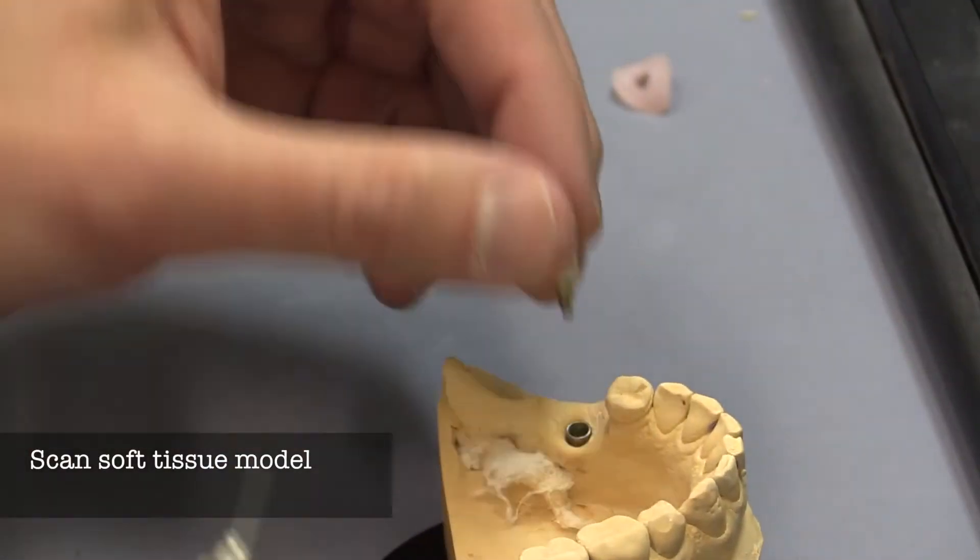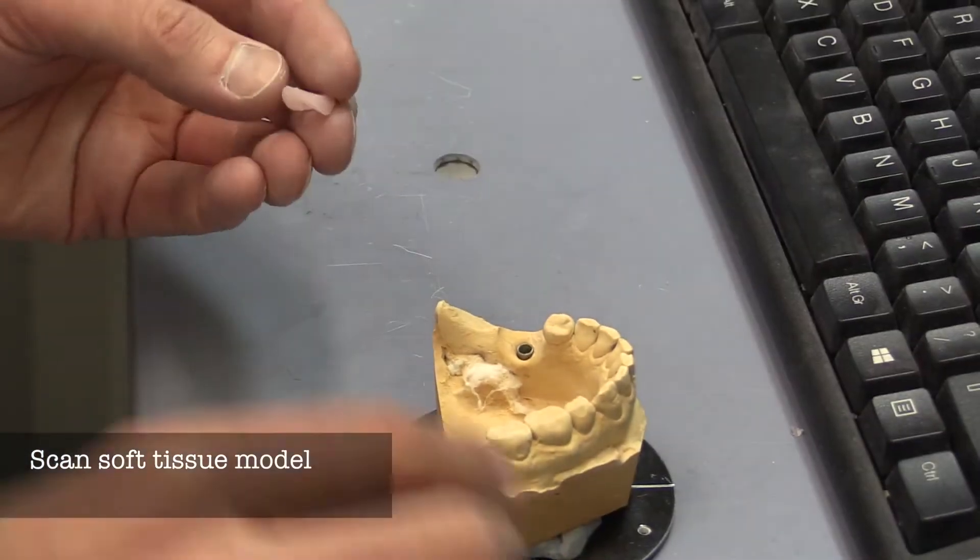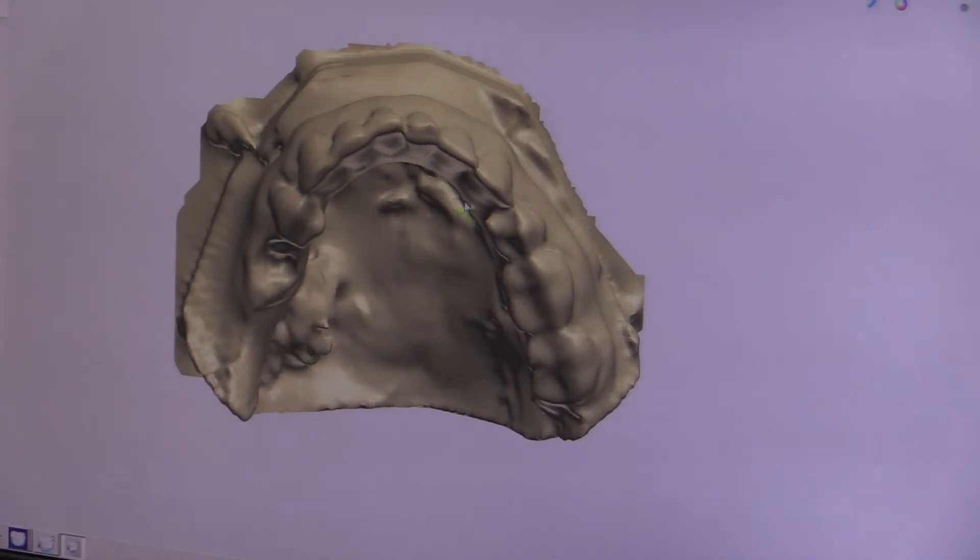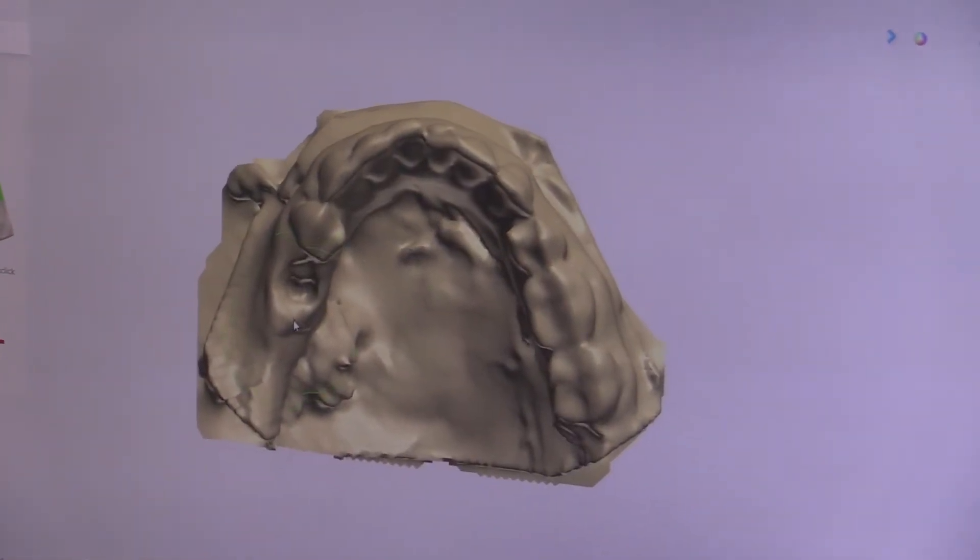As we take this off the model, we can start and scan the soft tissue as well. We want to have a scan of that so we can start to see the three-dimensional nature of this implant.